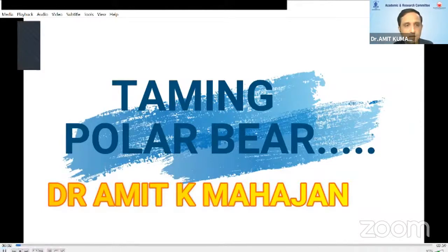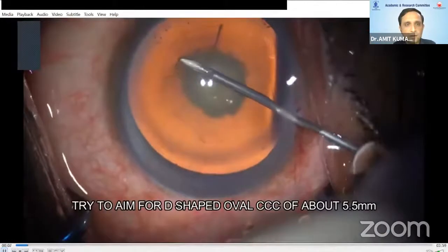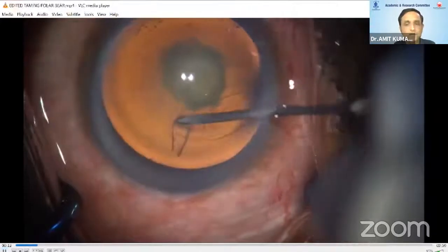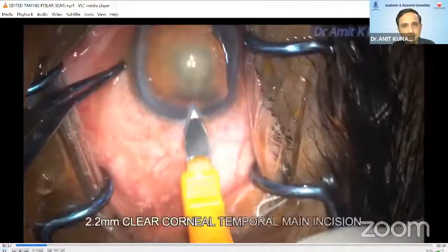...have been said and done about the management of posterior polar cataract but still the mystery continues. So in this video, I will be sharing a new technique of nucleus debulking in slightly harder grade of posterior polar cataract. The first and the most crucial step is a properly sized capsulorrhexis.